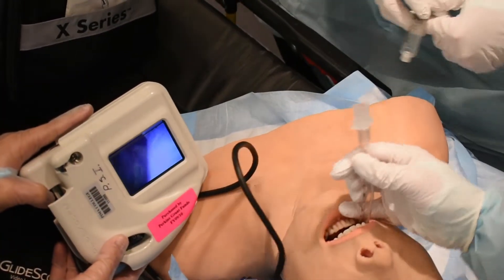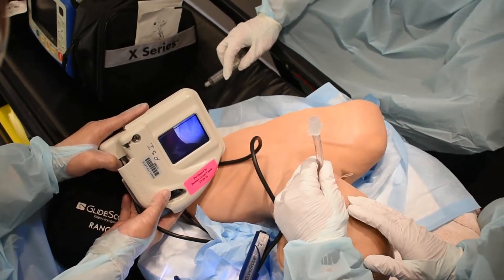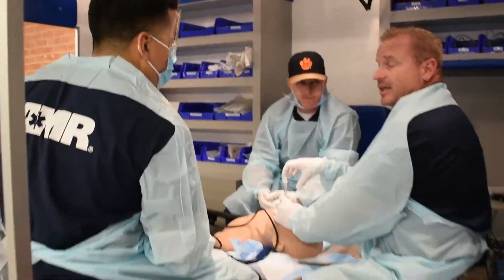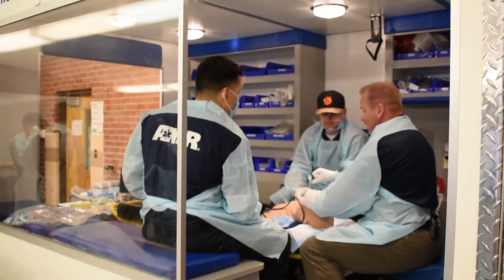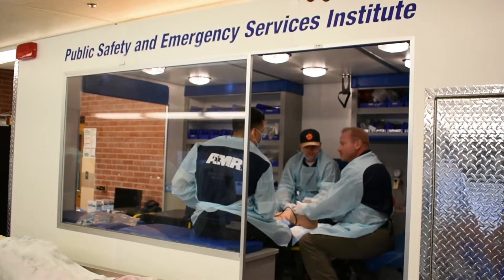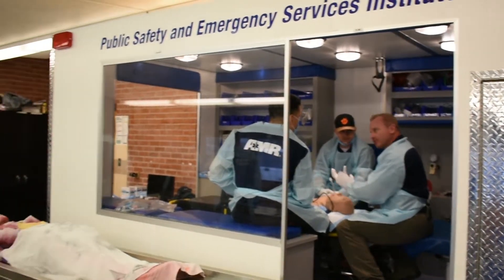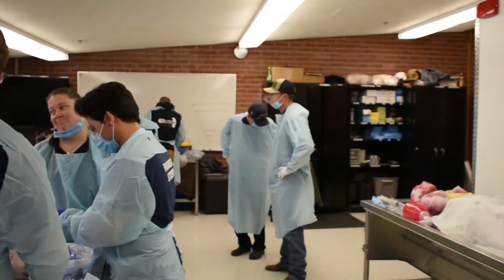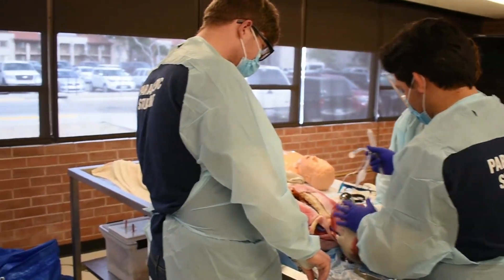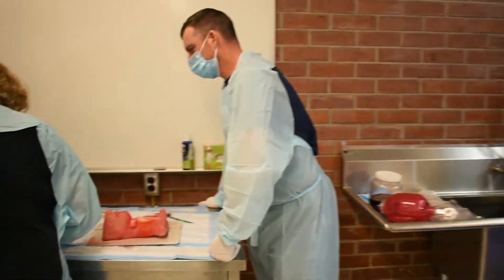Now pull your camera out, inflate the cuff, confirm with end-tidal CO2, BVM, and secure the tube. As the intubator, I always suggest bagging your own patient at least 10 times first. That way, when I hand the bag to someone else and come back every couple of minutes, I can squeeze the bag and compare compliance — if it feels exactly like when I first intubated, we're good. Compliance can vary between providers due to different adrenaline levels, techniques, and experience.